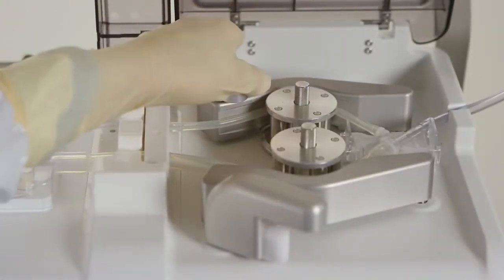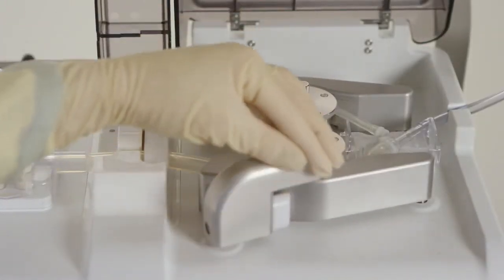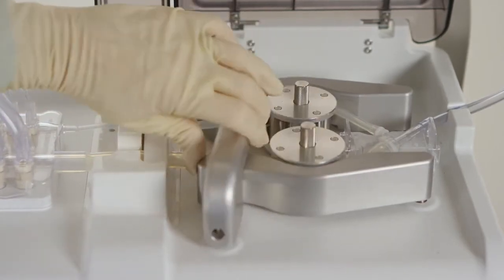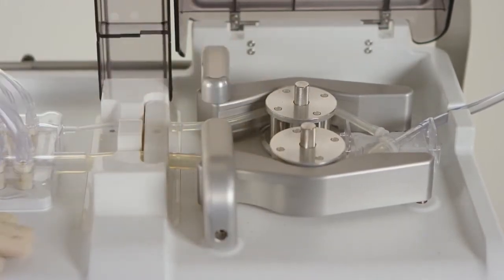Rotate the platen locks toward the platens to secure the platens in place around the tubing. The tubing should appear slightly compressed.